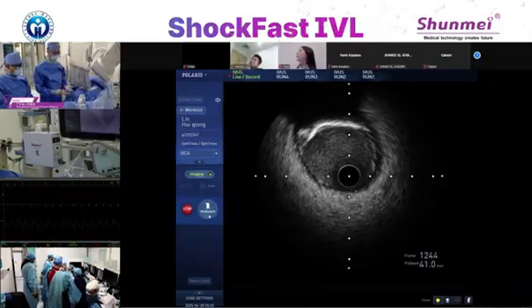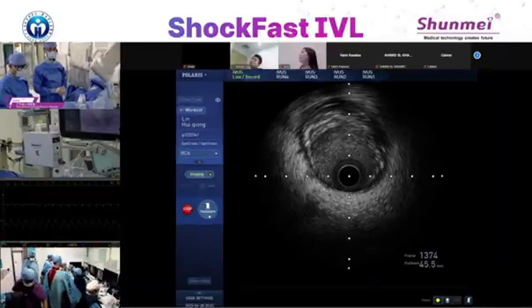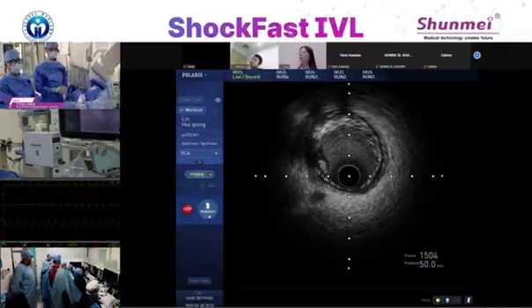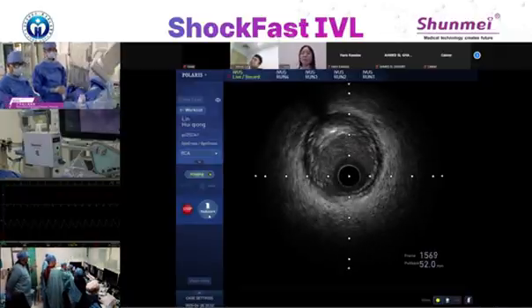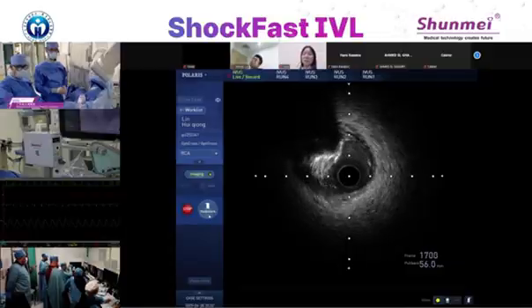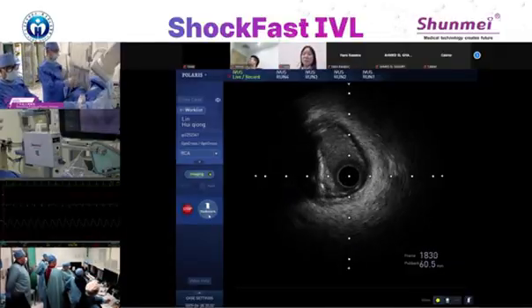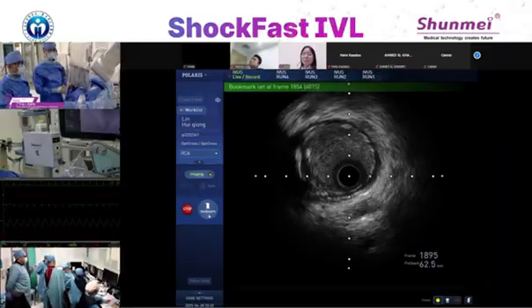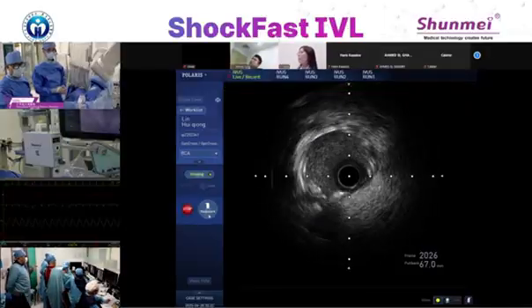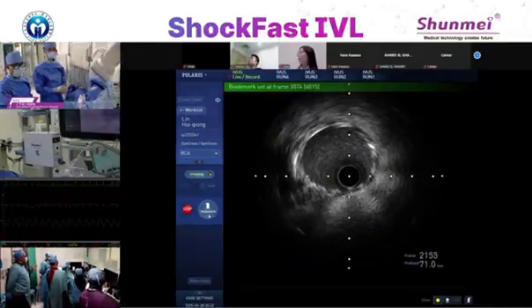Here is the segment between two stents. Some calcium over here. Eccentric distribution. The room is a little bit small, but I think it's acceptable. Oh, okay, here, yeah. Here's where it looks hazy at the angiogram. Okay, the proximal stent is also well expanded and well apposed.